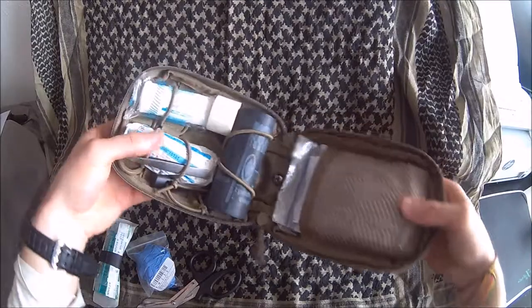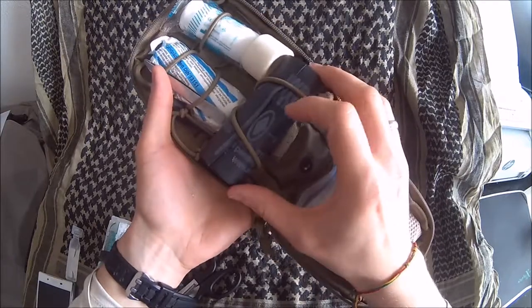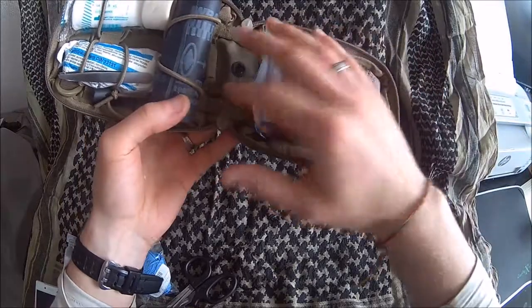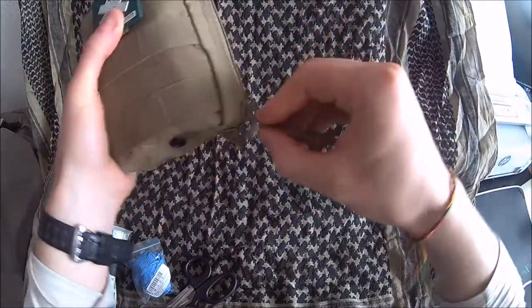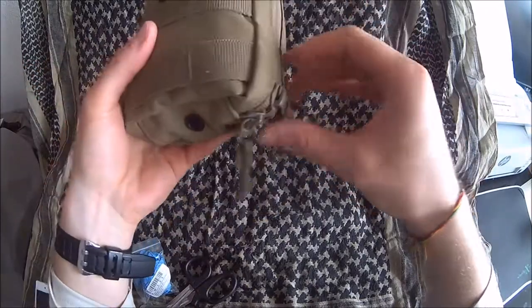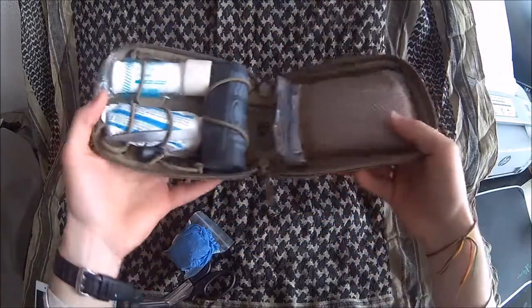Now you can see the basic layout. On the bottom I have a SWAT-T tourniquet — really, really good compact tourniquet. As you can see, this is the item that uses most of the bottom space and it folds over on the side where there's basically nothing. The kit is also very compact; you can compress it a little bit more if you don't have that much space in your cargo pocket. You can strip it down a little bit and it will still be useful, but don't forget to keep the nitrile gloves in.